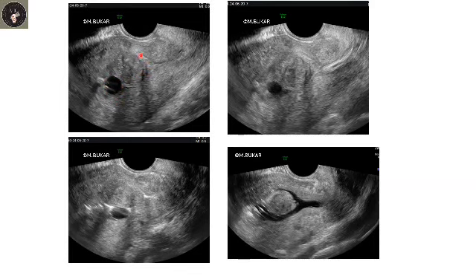If you want to assess the endometrial cavity, the catheter balloon should be around the level of the internal os, such that when you instill the fluid, it will distend the endometrial cavity. But if the catheter balloon is within the endometrial cavity, you will not be able to distend satisfactorily, and so lesions can be missed.